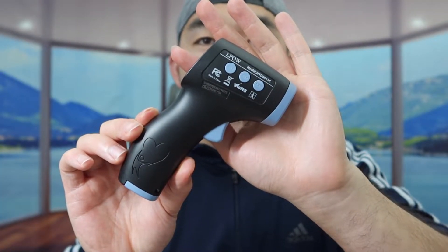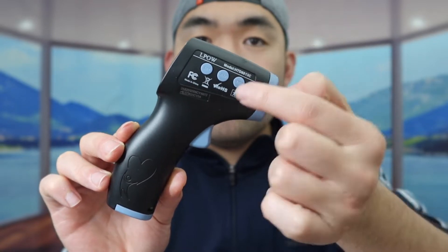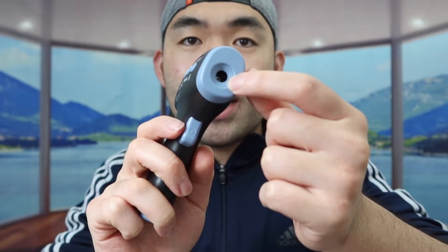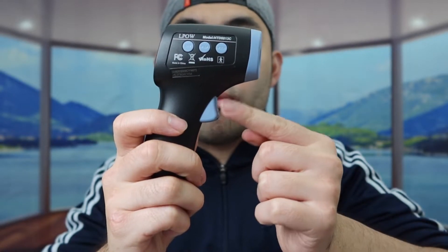Alright, so once you take it out, here is basically what the product looks like. Right here on top you can see we have the brand logo. Right here you can see we have a few buttons — there's a set button, a memo button, and a mode button. Right here in front is basically where you want to aim it at your body or anywhere else to check the temperature. Right here on the bottom is basically the button you want to press to activate it.